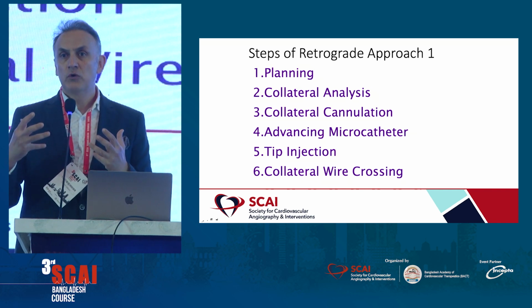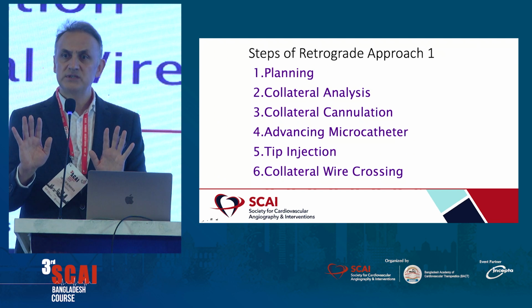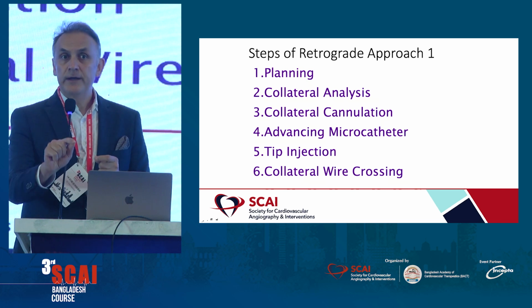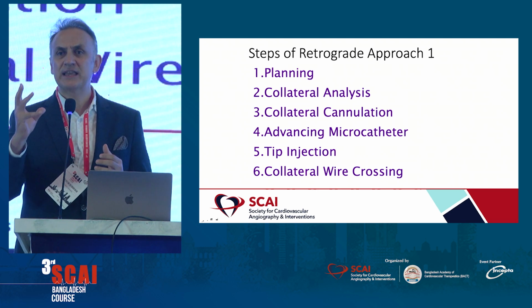So you should know that you may need to spend some time for only cannulation, okay? So you have to be very patient. Sometimes it is difficult. And then after cannulation, we have to advance our microcatheter to do collateral, and then better to do tip injection. Especially for the beginners, do tip injection to see exactly where you should go.